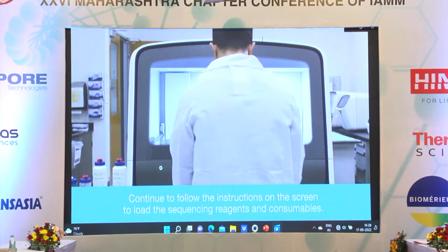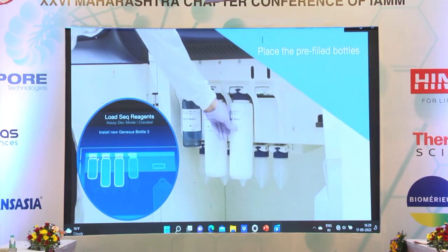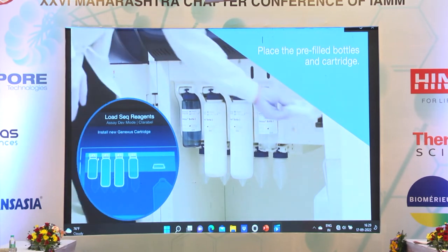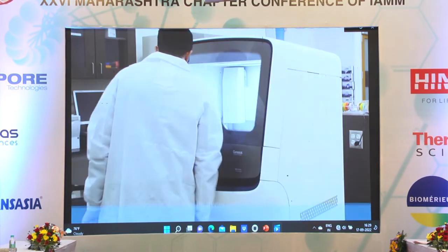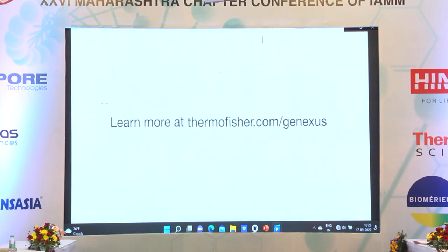Continue to follow the instructions on the screen to load the sequencing reagents and consumables. Place the pre-filled bottles and cartridge. That completes the setup. Now you can walk away and come back when the run is complete to review results and generate report.